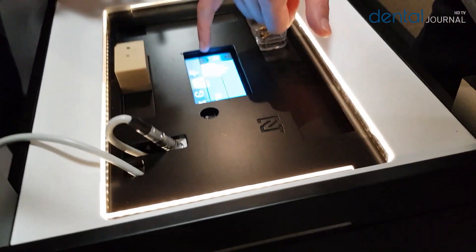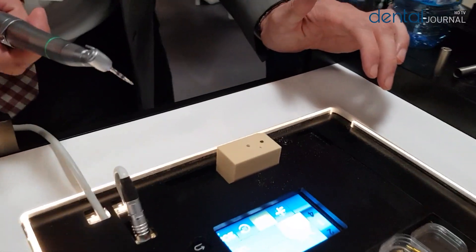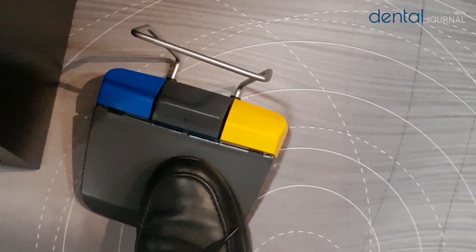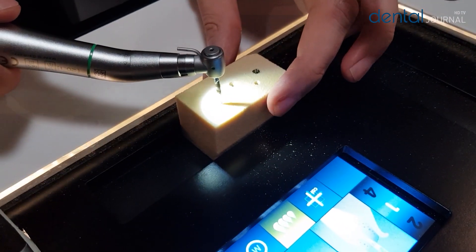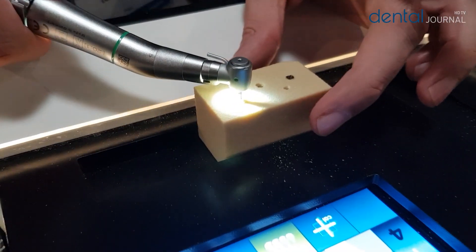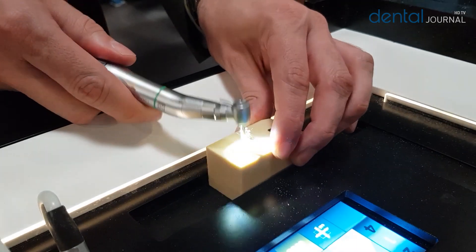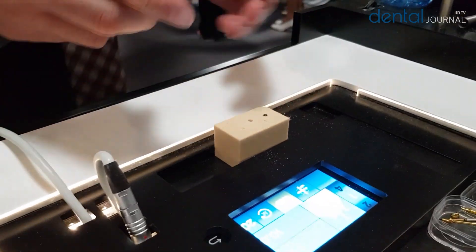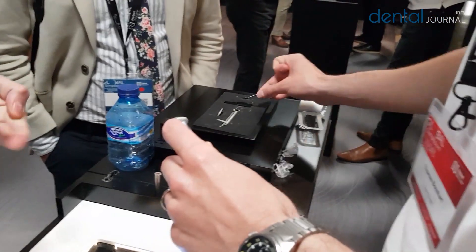It is new that you start with the director, a drill at 1200 RPM. It's very small because you're only drilling the direction for the implant — a small hole into the bone — and after this you take a second tool.